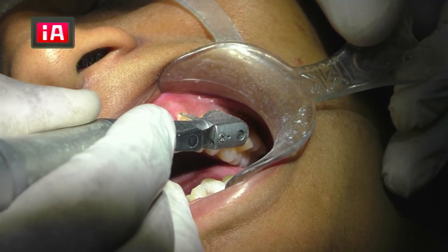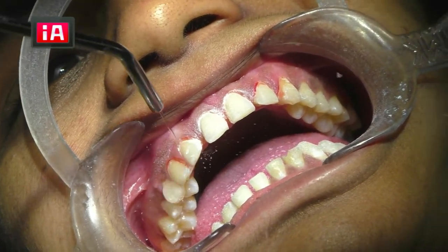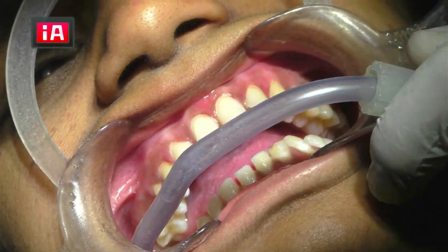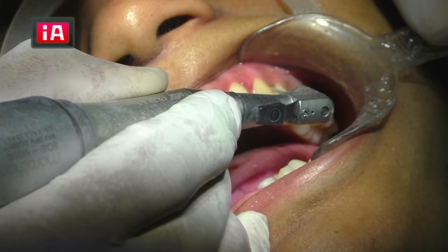My preparation is always on the enamel. It doesn't have any sensitivity, which means the preparation is on enamel. If it is in dentin, there is sensitivity. If it is closed, it's very easy. It does not have any sensitivity, meaning my preparation is on enamel. Always it will be on enamel.